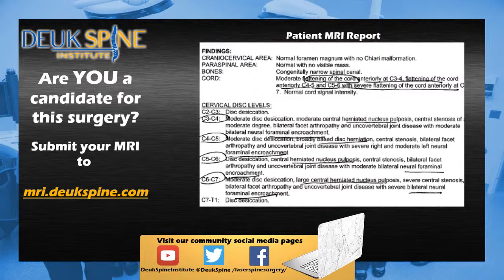All right, everyone, Dr. Deuk will be joining us in the room momentarily to answer your remaining questions. If you look on the screen now, we have the patient's MRI report up. You can see that the study does indicate the levels we just operated on were herniated and the likely cause of her symptoms. We hope after this surgery she'll be completely symptom-free, and we'll follow up with her on a different day where she can deliver a testimonial either after surgery or in the doctor's clinic. Please type up any remaining questions you have now, and the doctor will answer them shortly.